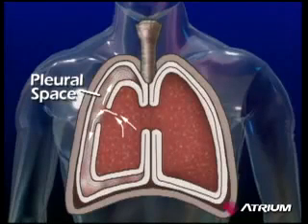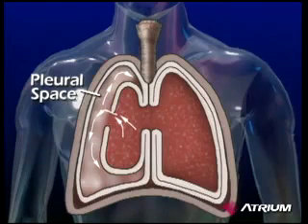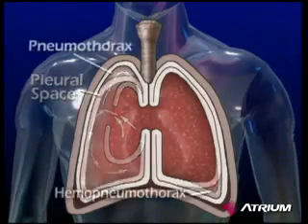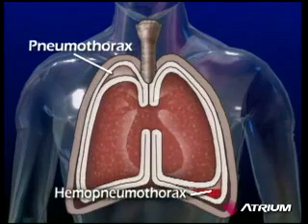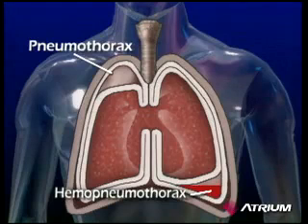When the chest wall is opened either by surgery or chest injury, the inrush of air causes the vacuum in the patient's pleural cavity to escape. Since the normal negative pressure or vacuum is no longer present, the lungs may partially or fully collapse, as they depend upon this negativity or vacuum to stay fully expanded. Without full lung expansion, the patient experiences pain and great difficulty in breathing.